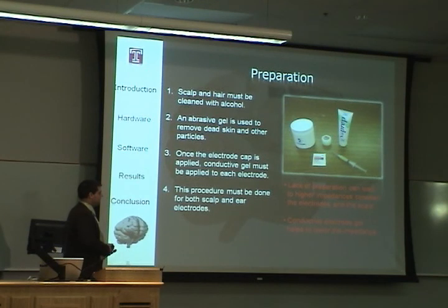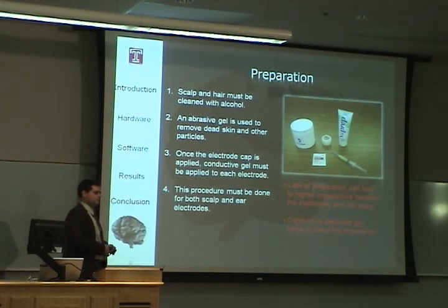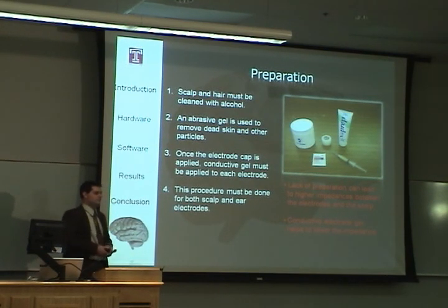That's pretty much it. It's a rather long procedure, and Matt talked about using active electrodes in future designs, and this will help cut down on using gel. So it's speed of preparation. Did that answer your question?